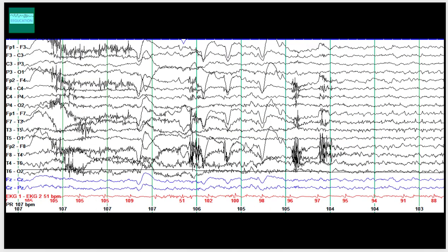Let's move on to the next channel. There are a few things that are quite obvious. You see muscle artifact — muscle artifact is quite obvious here, and you're seeing it in several channels.